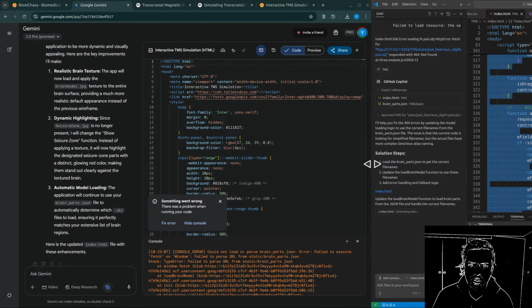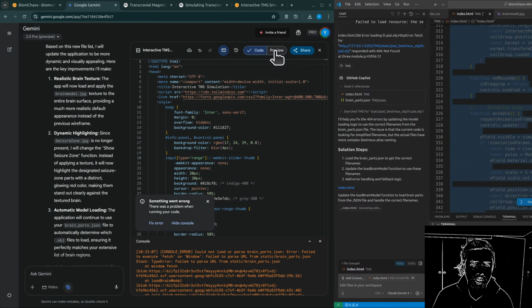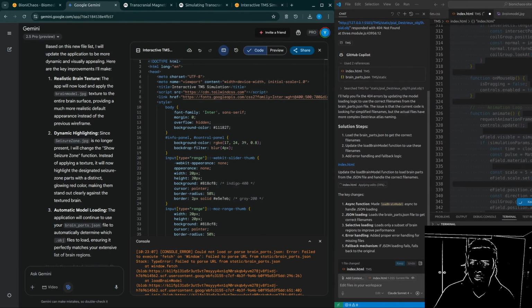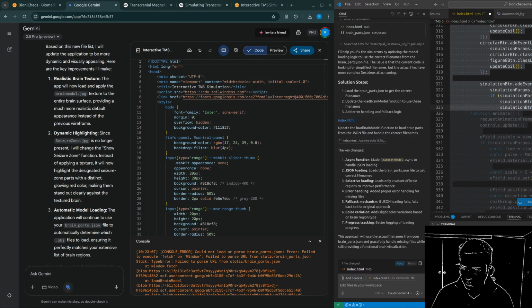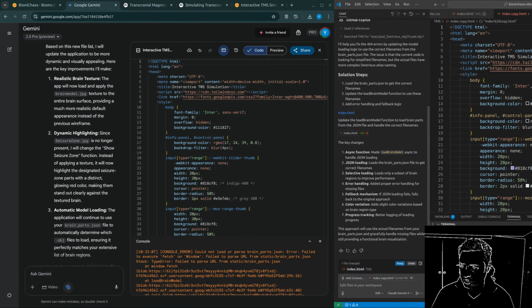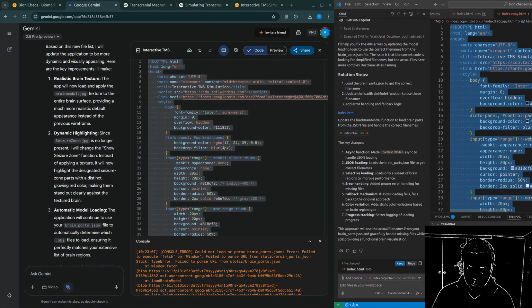That saves some effort. And just like in a real TMS session, where you place the coil and how you angle it must be super important. How's that handled in the simulation? Oh, absolutely critical. Coil positioning needs to be defined precisely in the simulation. You basically tell the software exactly where the coil is located and how it's oriented relative to that digital head model. Mimicking the real setup. Exactly, mimicking how you'd position it on a real person's scalp.